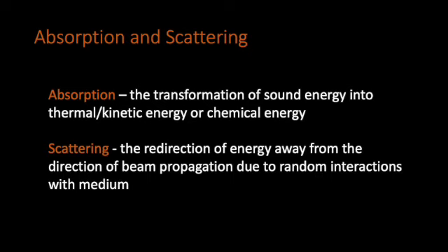There's also this concept of scattering, and scattering I like to think about as if I was back on that beach analogy. We have the waves coming in and they're crashing against the rocks and the sand, and normally, you know, the amount of energy that's held inside a wave is huge, and we can imagine that those ocean waves coming in would just push all that sand in one direction. But instead, what we know is that those waves break up. They scatter into 1,000 different directions, interacting with individual particles of the sand.